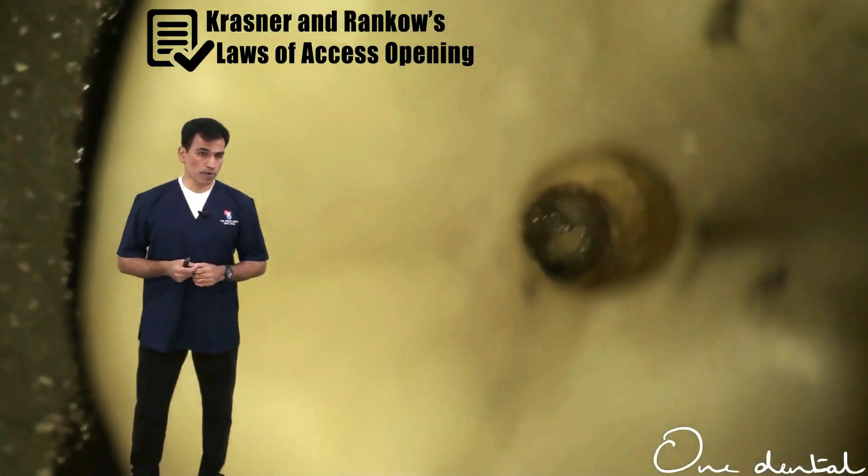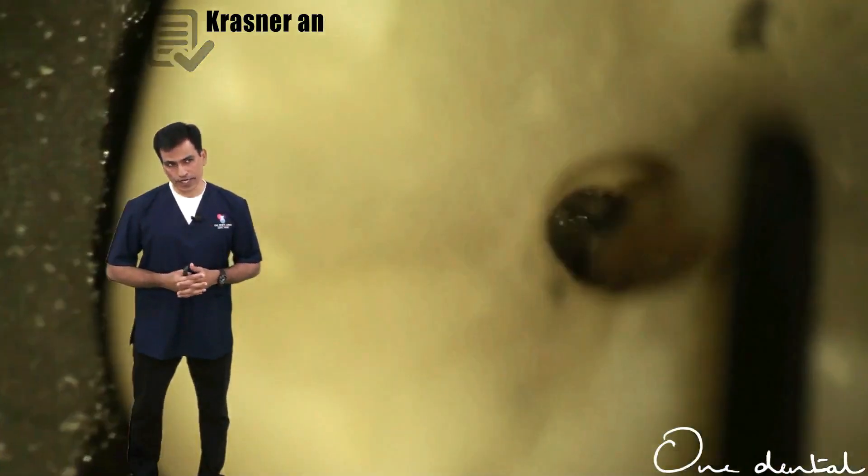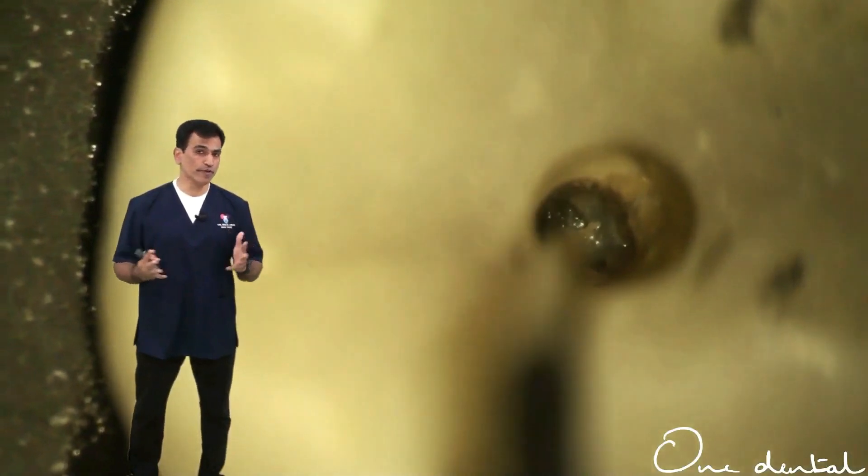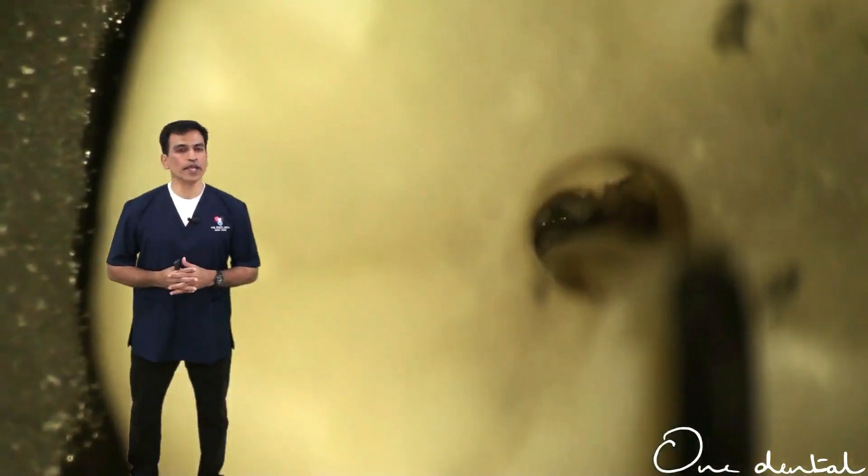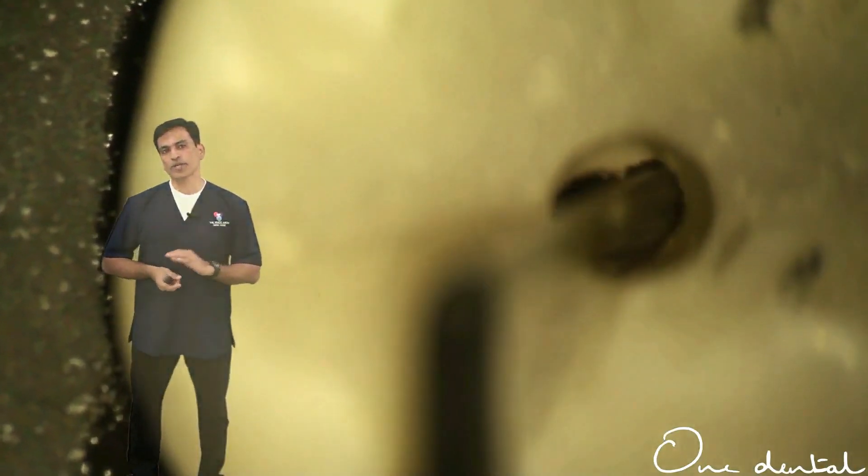To use a DG16 probe, one of the must-haves in endodontics, it's a long straight probe with two different angles. Try and negotiate and try and remove the contents that are in the root canal system.